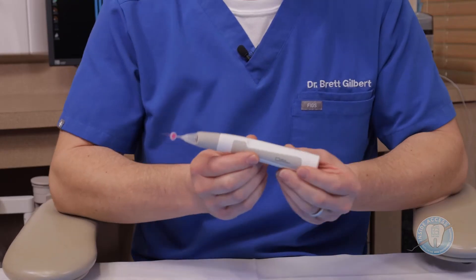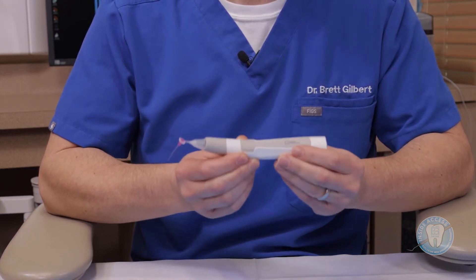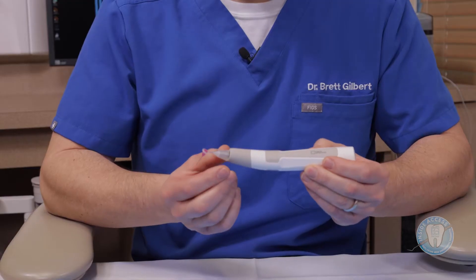MetaBioMed is a company from Korea who creates products for other companies and now has a really nice line out in the U.S. marketplace. I wanted to introduce you to something I've become fond of called the EQS — this is actually a sonic-powered irrigation activator. I've tried many different activators over the years, and I think this one has some unique properties that I wanted to share.